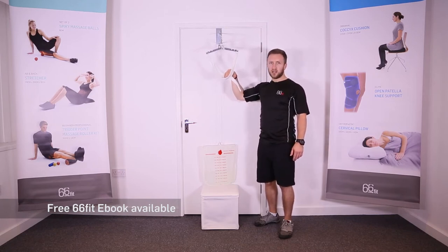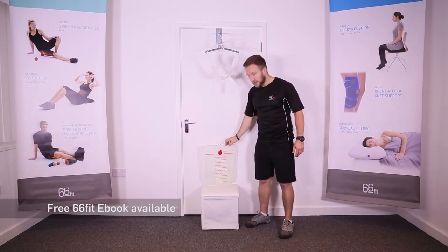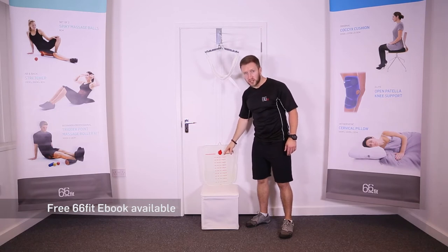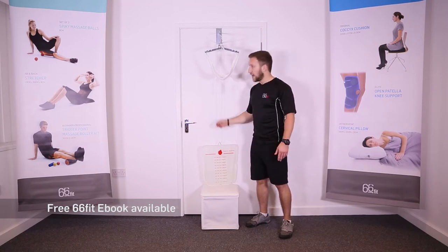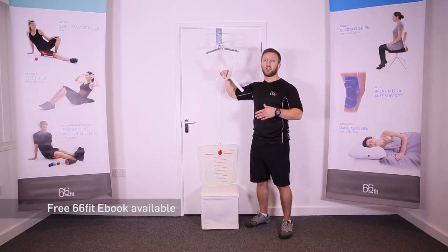Before using this product, we recommend that you get advice from your therapist to ensure that you fill the bag with the correct amount of water, so as you don't apply too much force and therefore too much traction, and also that you're applying the correct type of traction, either flexion or extension.